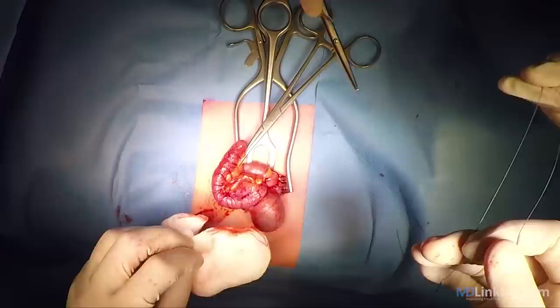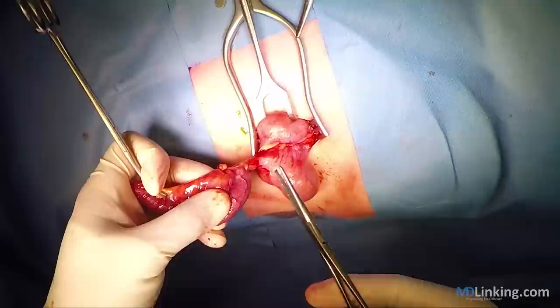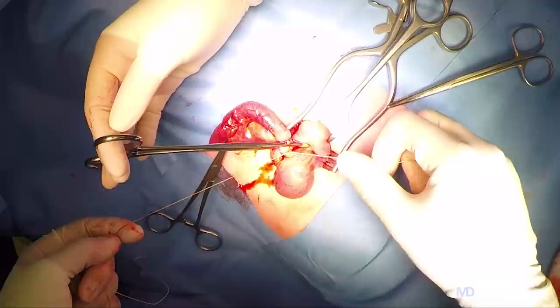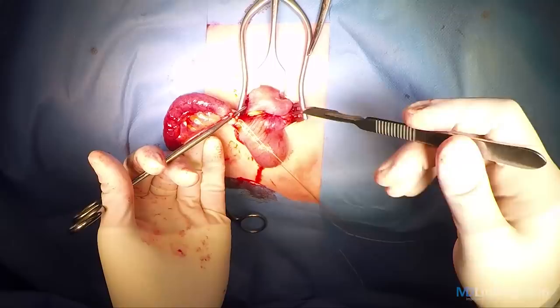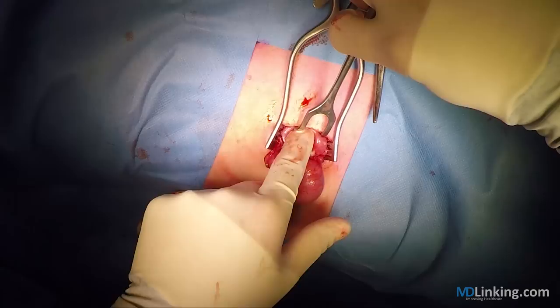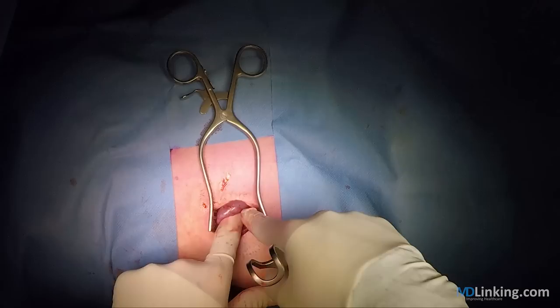So once we're done with the ligation of the artery, we can crush the base of the appendix. Place the clamp just distal from the crushed area and place our ligature around it. Then you can cut the appendix just below the clamp and remove it. Make sure that your ligation is properly secured.